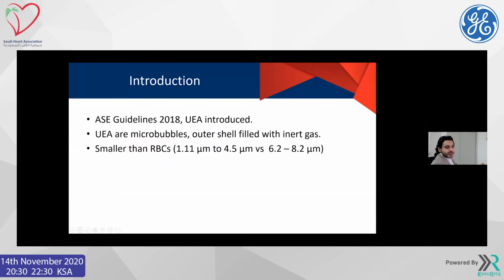Since 2018, we have a new nomenclature for contrast. Now it is called the ultrasound enhancing agent. The reason is not to confuse it with contrast that has iodine material, which can cause harm to the kidney. This is a different medium. To call it a contrast is still okay, but for the patient, calling it an ultrasound enhancing agent is better terminology.